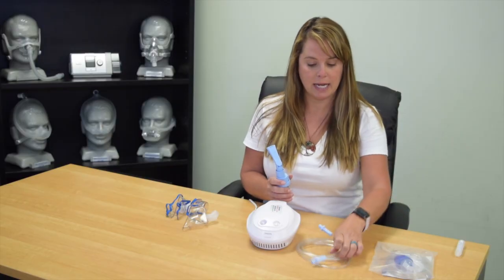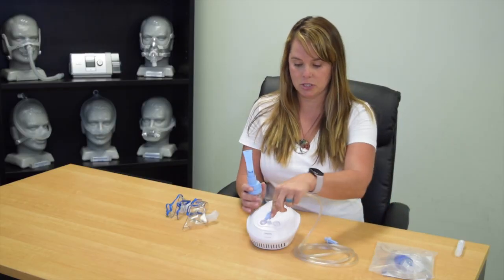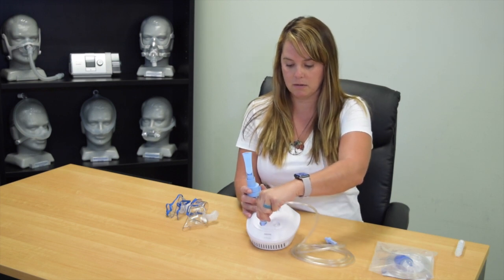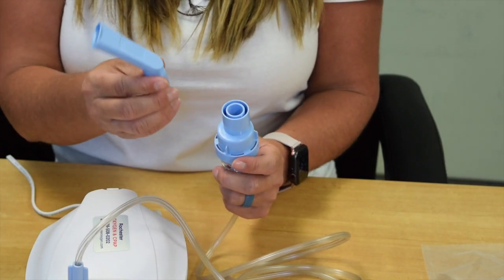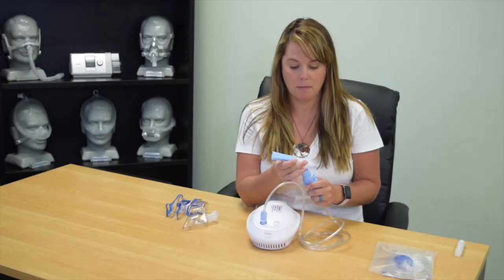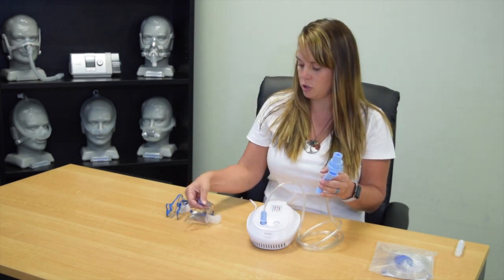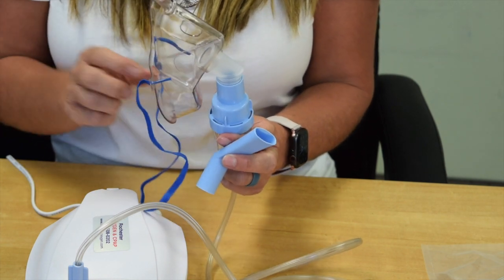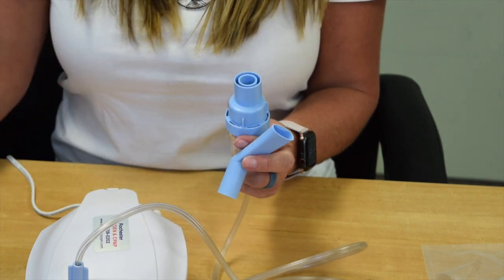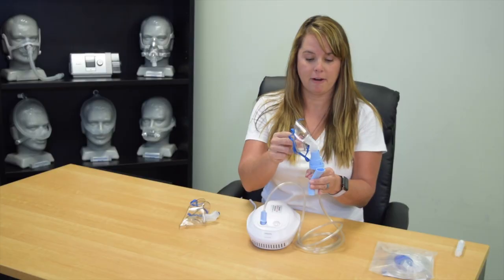So my tubing on the ends are identical. So this end's just going to go into my compressor, and this end's going to go into my nebulizer kit. So this kit comes with a mouthpiece. You do want to use the mouthpiece if you're able, because you will receive more medication. If for some reason you're not able to use a mouthpiece, there are masks available. So you can see this adult mask just fits right on there, just like that. And we also have pediatric masks for our little ones.